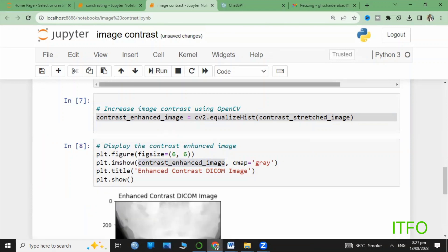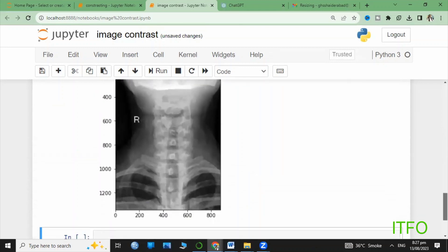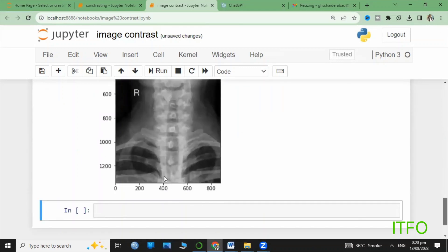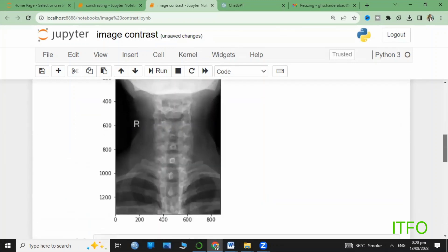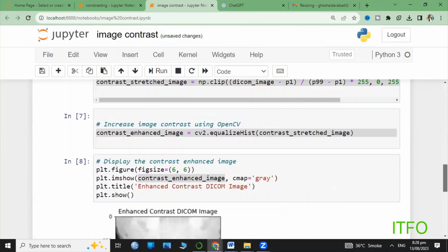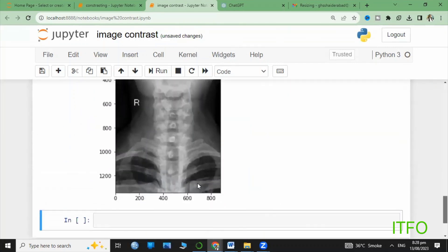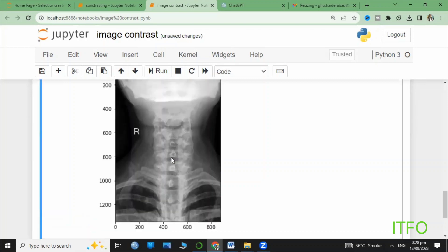Here you can see the difference - this is the contrasted image and this is the original image. You can observe the ribs, bones, skeleton, or spine. Here the white portions or white bones are more colorized.